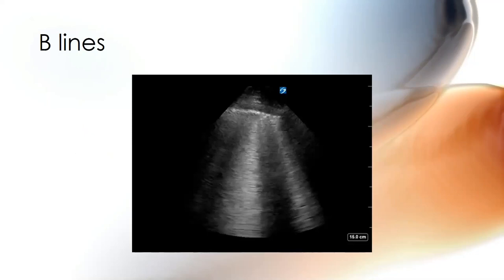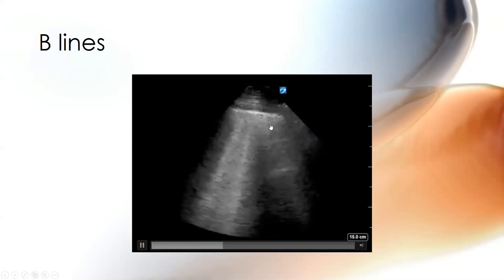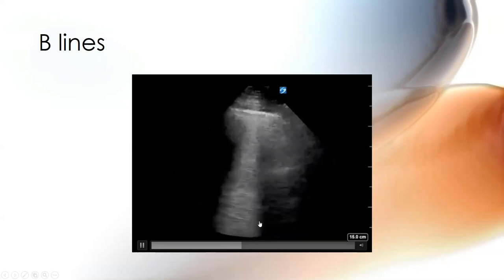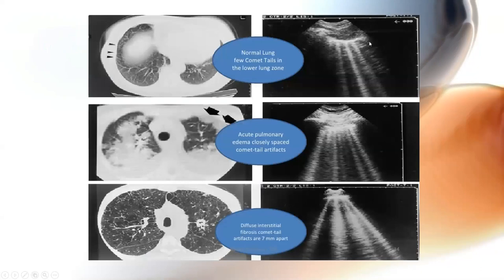These are examples of B lines. So this is to show you the dynamic part of it. As a still image, you should be able to recognize that this is one fat B line or confluent. There may be several B lines all joined together. So again, skin, pleural line, and you see these comet tails, lasers, headlights, whatever you want to call them, shining all the way down that extend the entire length of the screen. More examples: this is a curvilinear ultrasound probe image. You've got very distinctive separate comet tails, B lines. Here, they're more closely spaced together. Here, they're a little bit further apart and they're very wide.